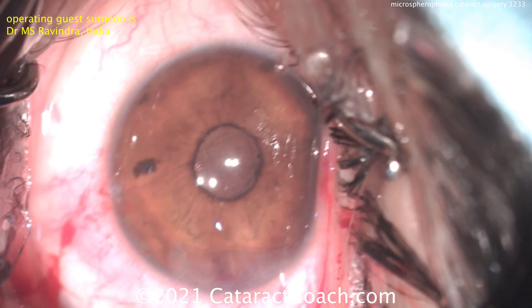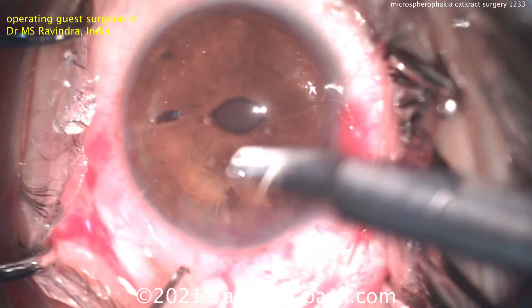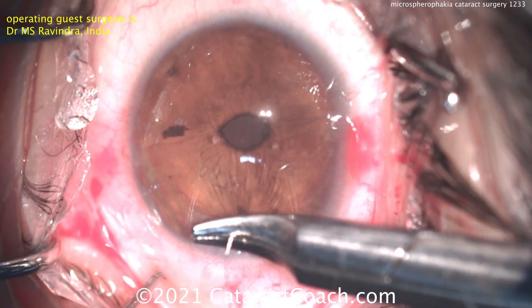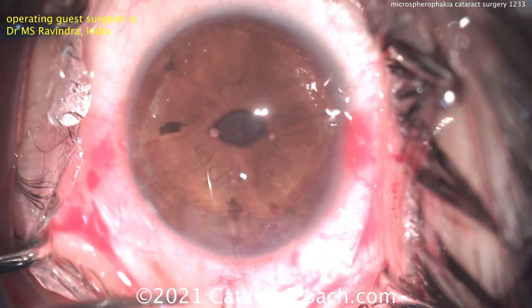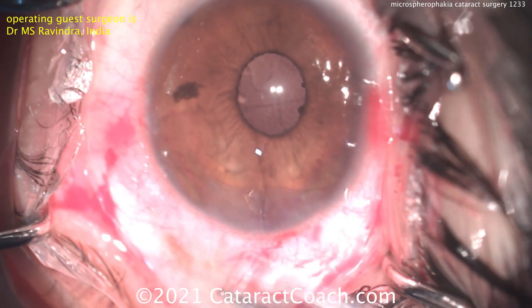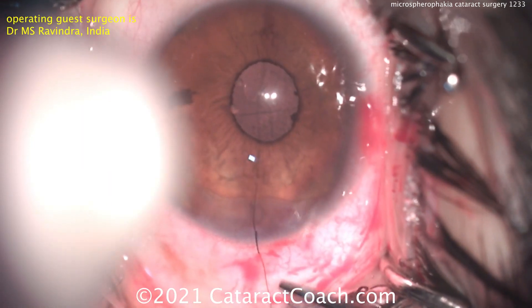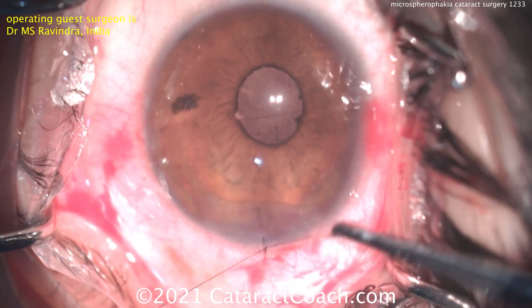Looks really nice — the lens is staying pretty well-centered. There are other options for IOL fixation: you can do a sutured lens, a lens sutured to the sclera, a Yamane technique, an AC lens, or capsular tension segments on each side with a lens in the capsule bag. All these are appropriate options, and I like the technique that Dr. Ravindra has done here — beautiful outcome.